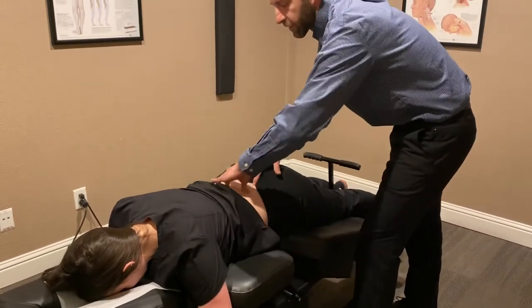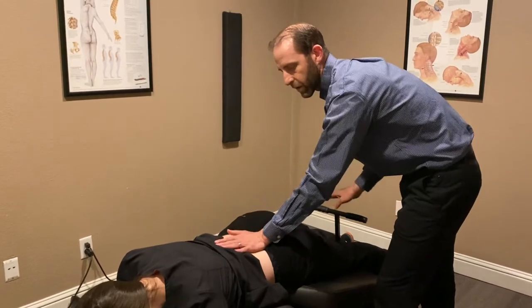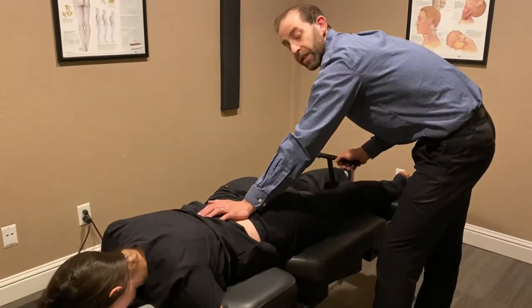So if someone's fairly acute, we'll keep it really slow, use a slight amount of pressure, and we're able to wedge each individual vertebrae open.